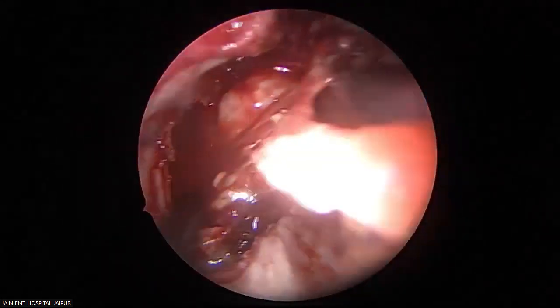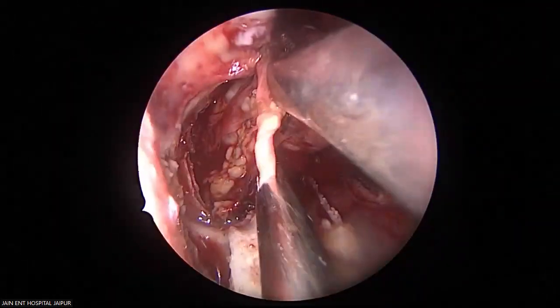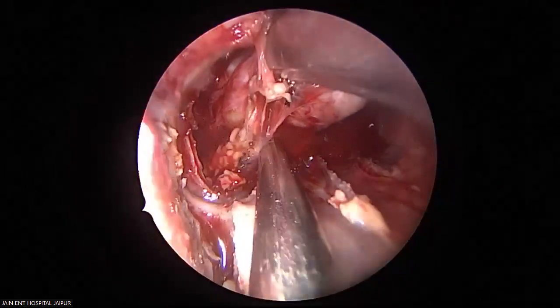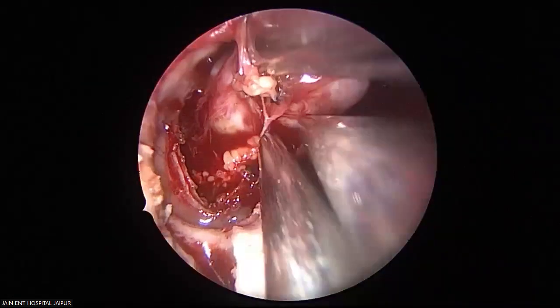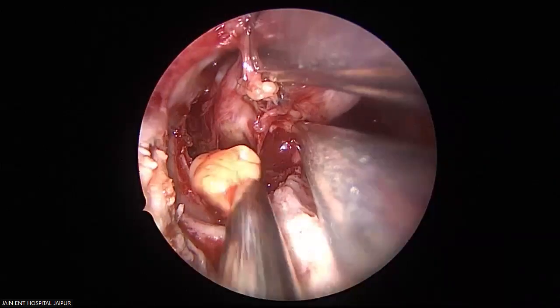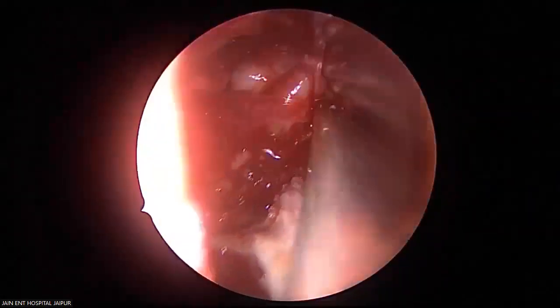Tumor has been pulled and held medially. See how the adhesion is being taken. Just beautiful. Coblator.